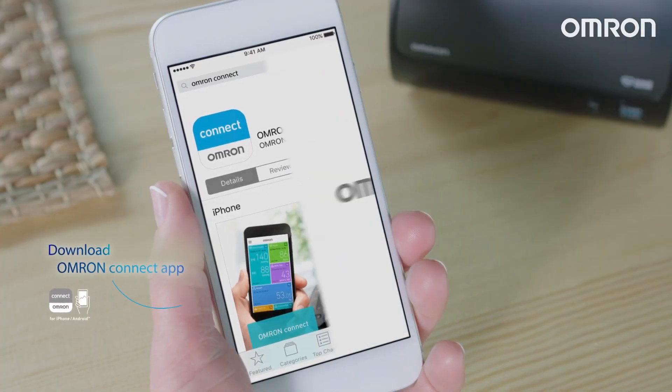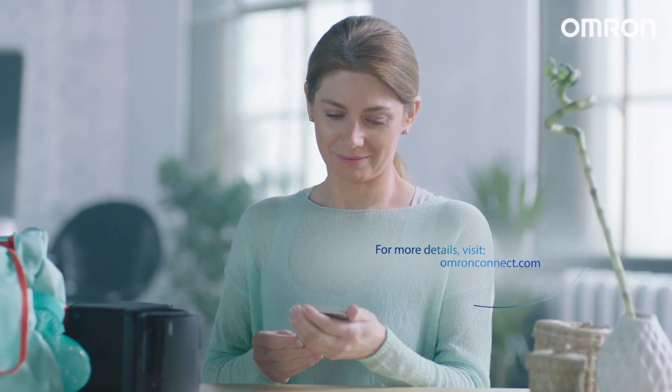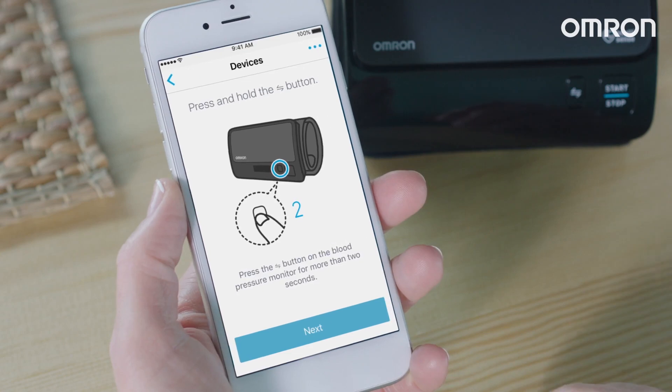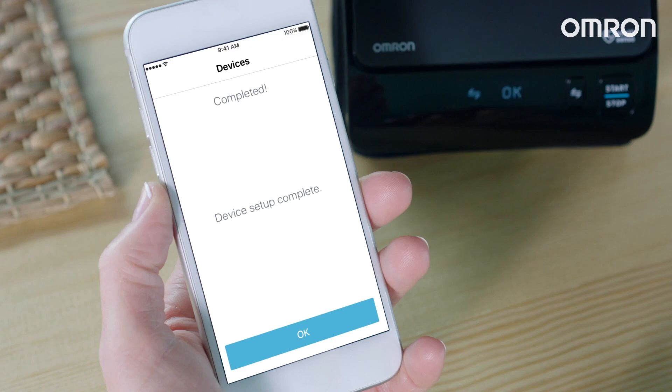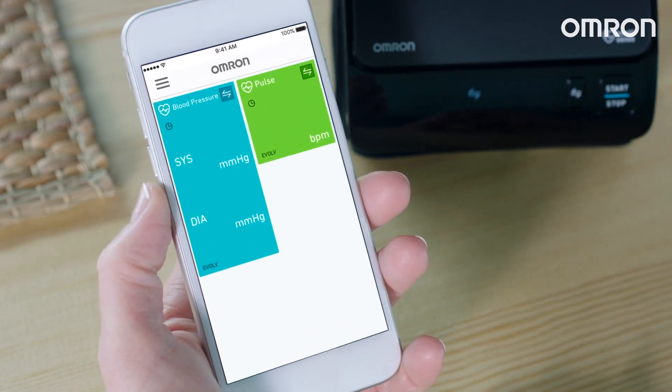First, download the Omron Connect app and turn on the Bluetooth on your smartphone. Then, pair the devices by pressing the connection button on your Omron Evolve for 5 seconds — just paired at the push of a button.